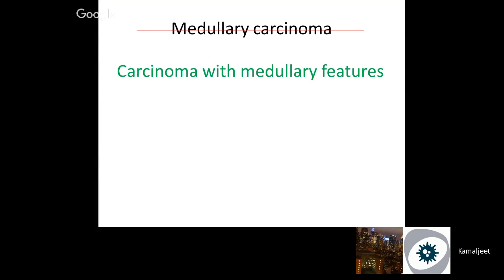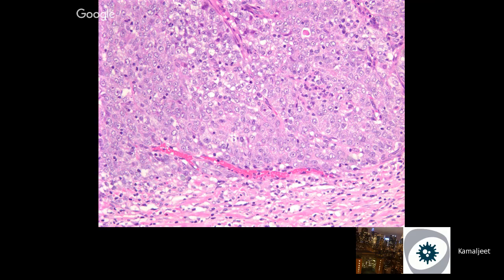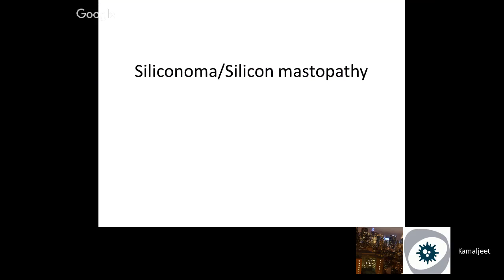Medullary carcinoma is out of fashion. WHO has something, carcinoma with medullary features, and I don't know if they might ask you. This is not medullary. This is something I took a picture that looks like medullary. So the nuclei are high grade. They look like syncytium. They have prominent nucleolus, pushing border, and there will be tons of lymphoplasmacytic infiltrate. That would make it a classical sort of medullary with triple negative markers.